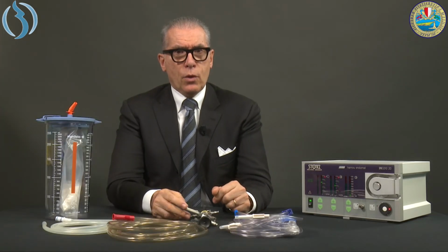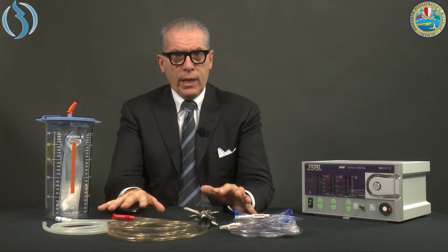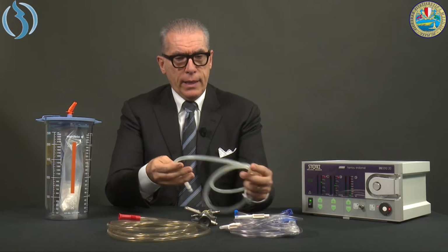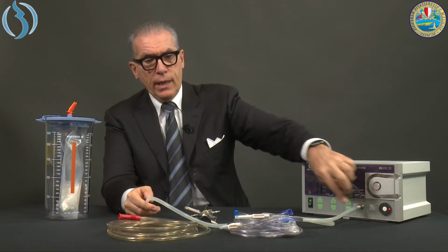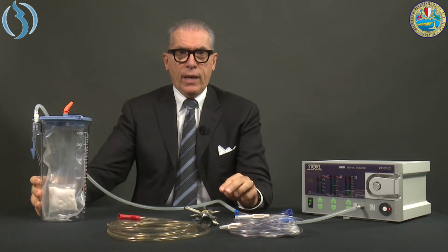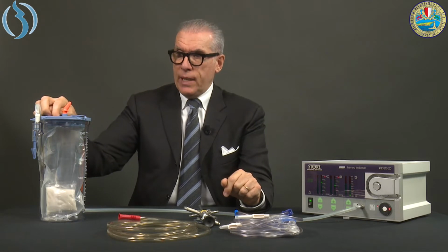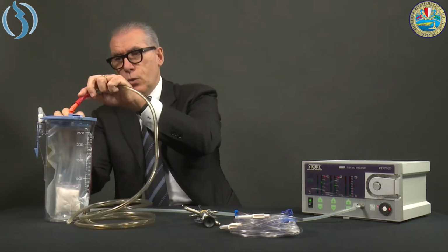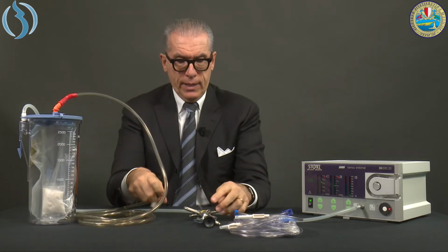Here we are with the connection of the tubing sets. You see on the table we have the receptacle and all the cables we need for the connection together with the resectoscope. The first cable is this one that goes connected to the aspiration part of the Endomat, as I told you before, and then plugs into the receptacle. So far, we have aspiration of air, thanks to the engine here, from the receptacle. The aspiration of air generates a vacuum. So this area should be connected to the tubes that then finally go into the aspiration of the resectoscope.